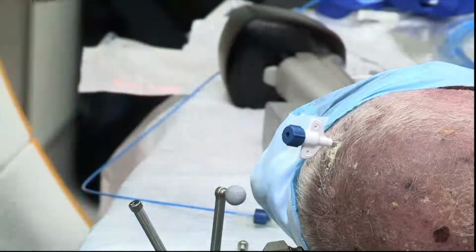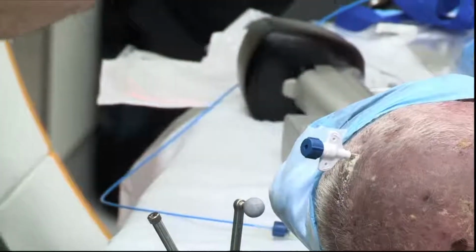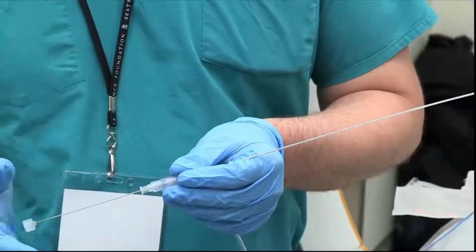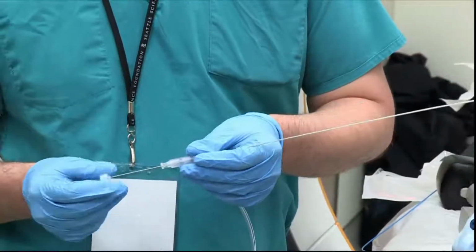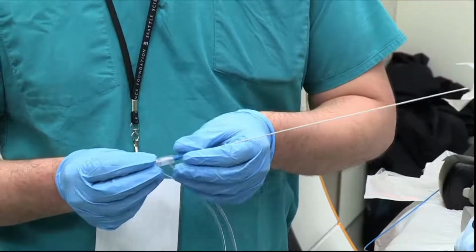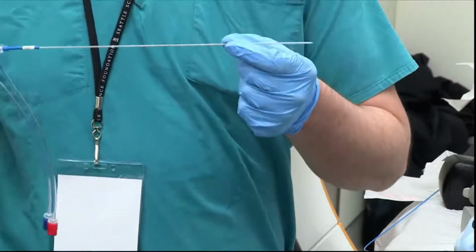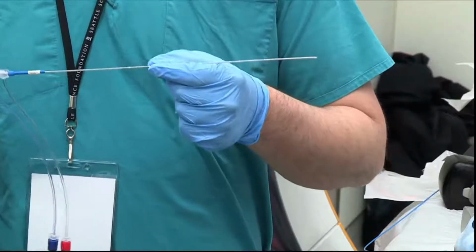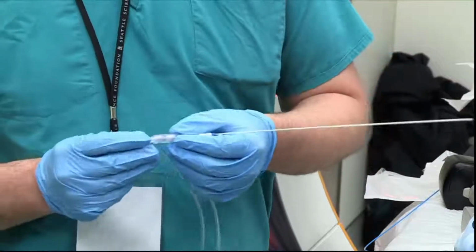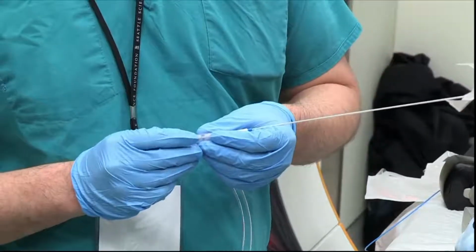So now we're ready to put in, basically this is the cooling sheath. This isn't actually the laser, but this is what we're going to introduce first. And then you have basically a stylet here to stiffen it. You want to be mindful also that this isn't cracked in any way. If this cracks, you're going to lose irrigation and you can heat up at that point. So you want to make sure that it's handled appropriately.